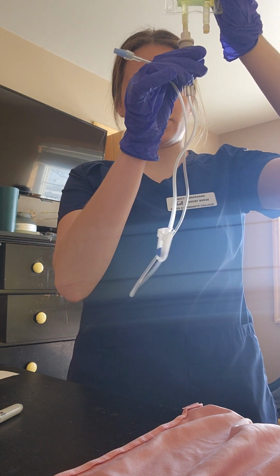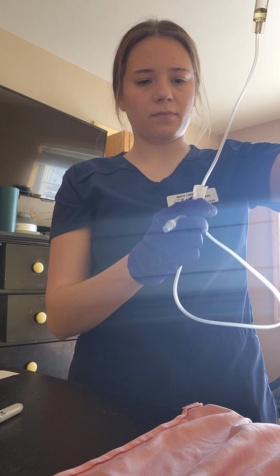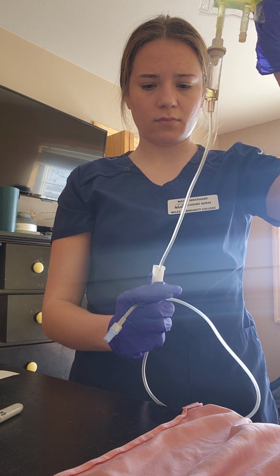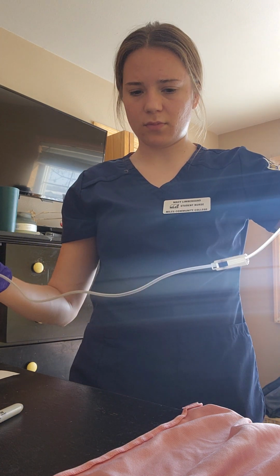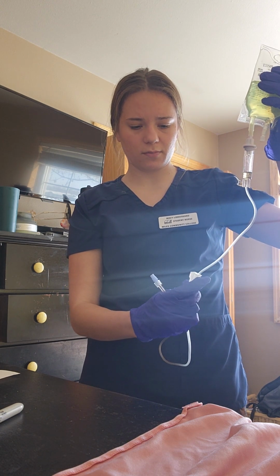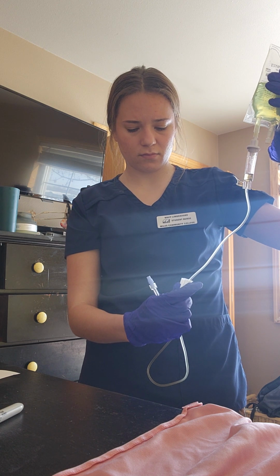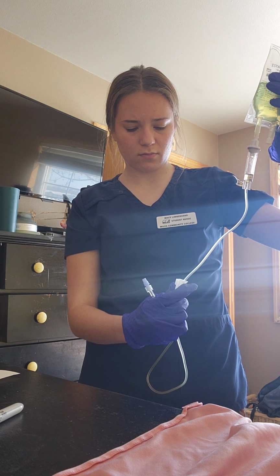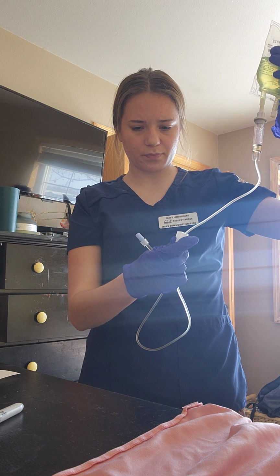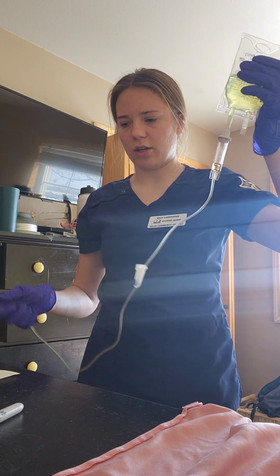And actually, I want some more fluid. Okay, and just letting it go all the way through the tubing, making sure to get all the air bubbles out. Okay, I might clamp it down again.